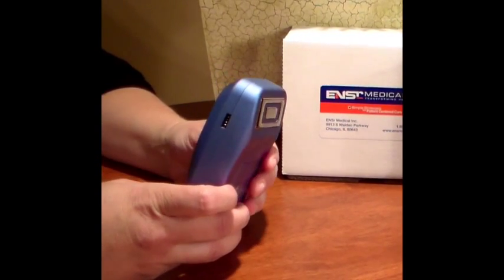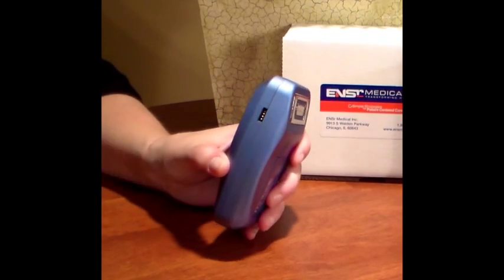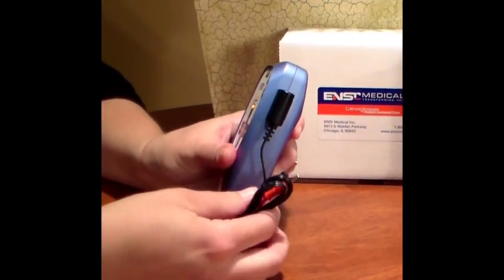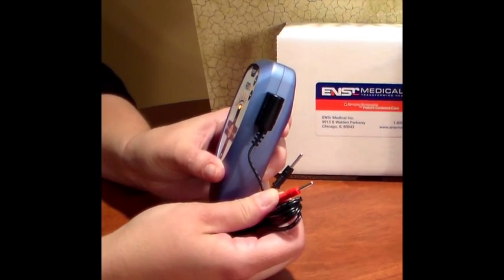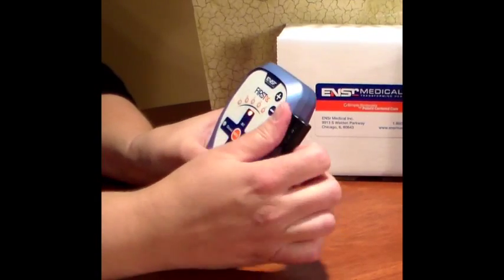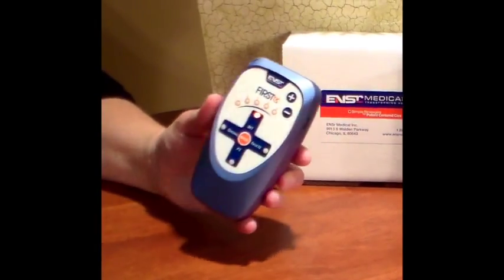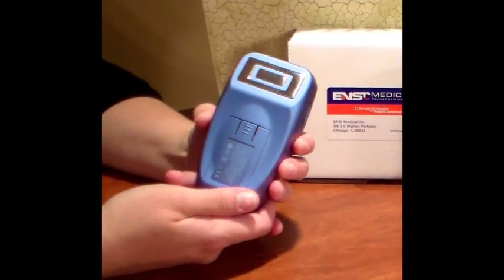The accessory input is located on the other side of the device, and this is where you attach your lead wires, where you can plug in electrode pads to be used on an extremity or joint. Finally, your battery compartment is located in the back.